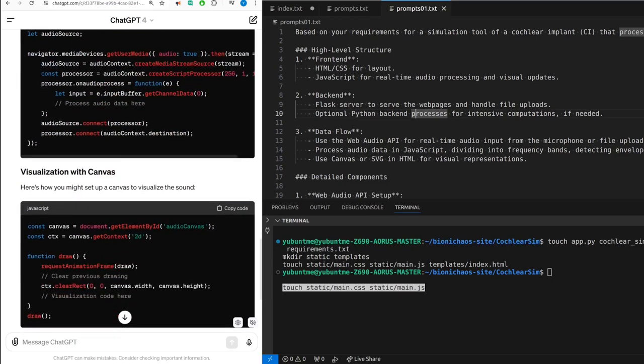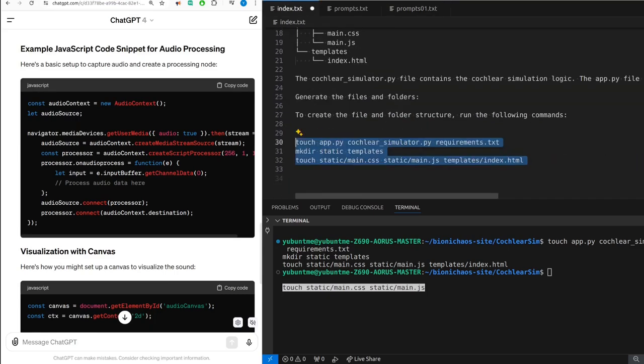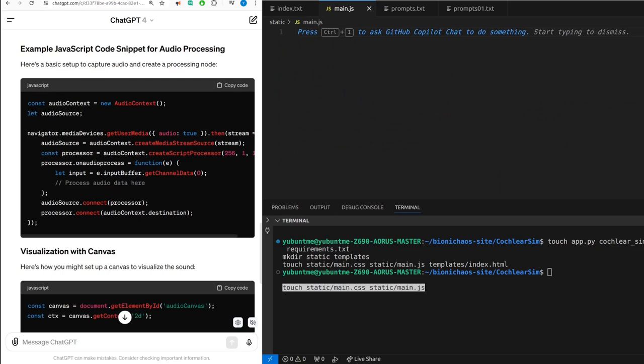Here's how you might set up a canvas to visualize the sound. JavaScript: const canvas = document.getElementById('audioCanvas'); const ctx = canvas.getContext('2d'); function draw() { requestAnimationFrame(draw); // Clear previous drawing ctx.clearRect(0, 0, canvas.width, canvas.height); // visualization code here } draw(). For more complex parts like synthesizing sound from electrode activations or setting up the filter banks, you can use prompts like: generate JavaScript code to simulate a bandpass filter bank for audio processing. How to create dynamic range compression in JavaScript for audio signals. This setup gives you a good starting point. Depending on the complexity and performance requirements, you might need to adjust or offload more processing to the server side.